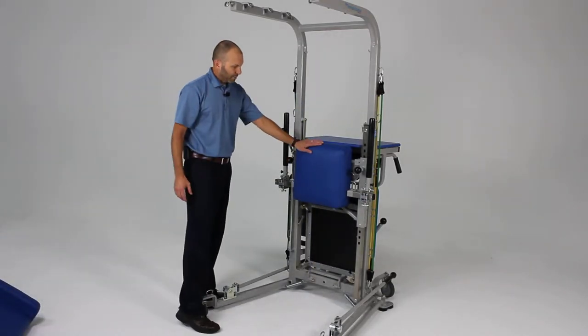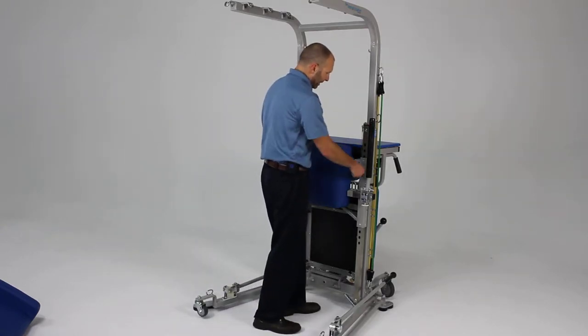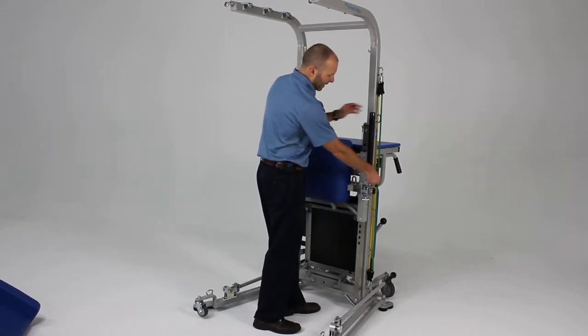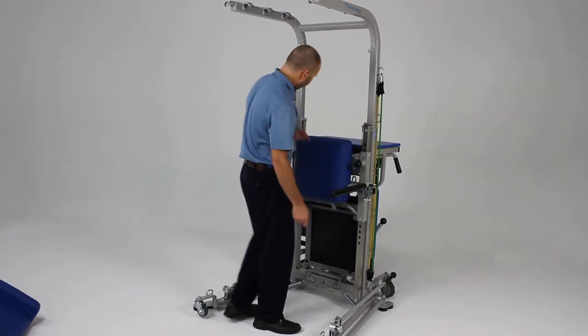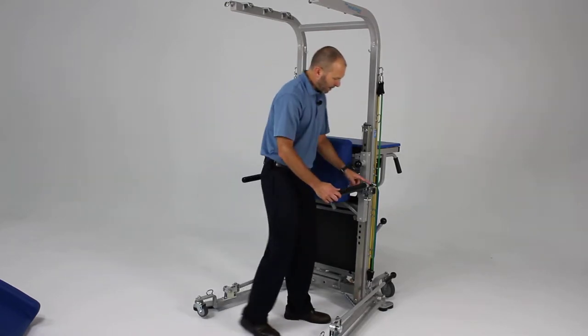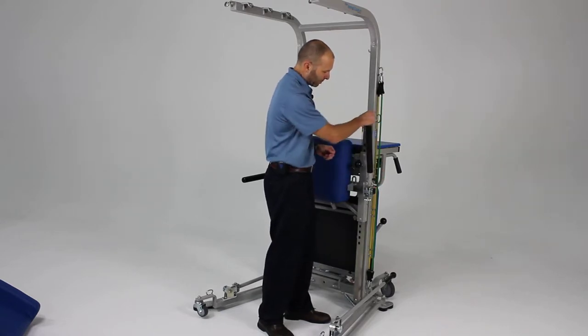Also on the front of the unit, we have a chest or back pad that can be raised and lowered. In addition, we have bars that the patient can hold on to for stability. These lock in place and can be unlocked by simply pulling out on the tab.